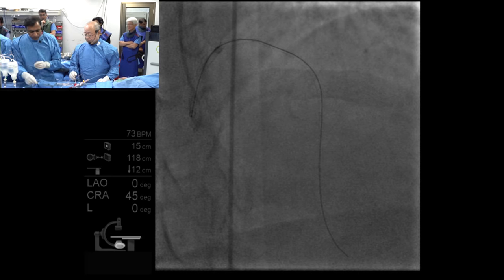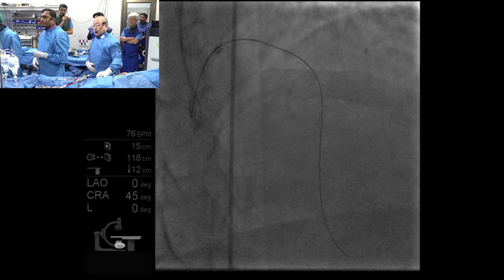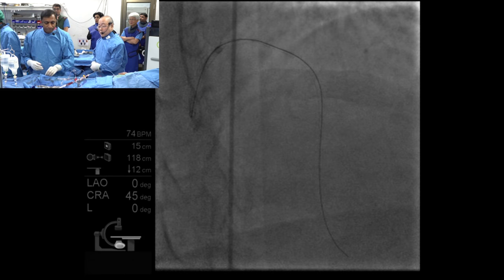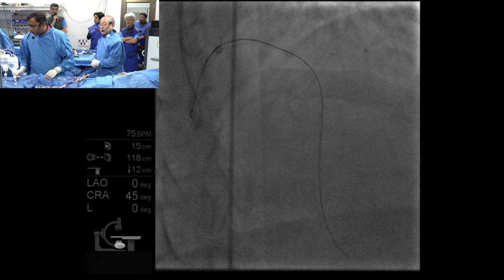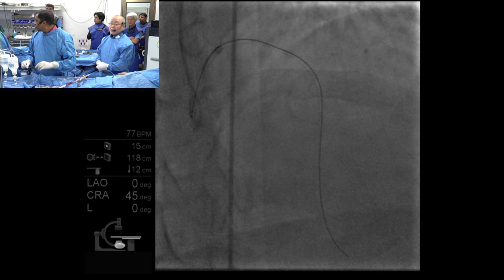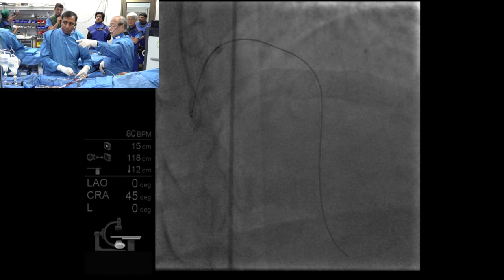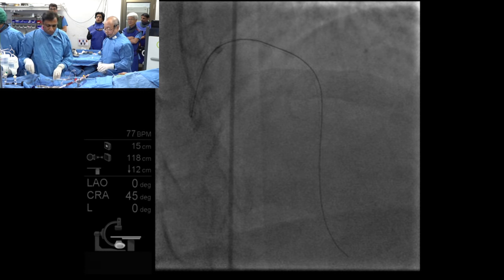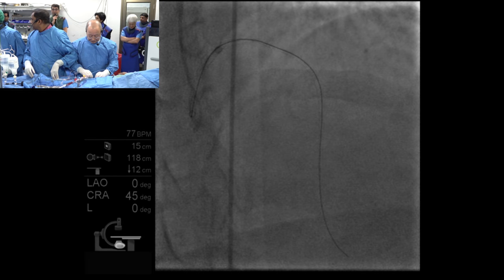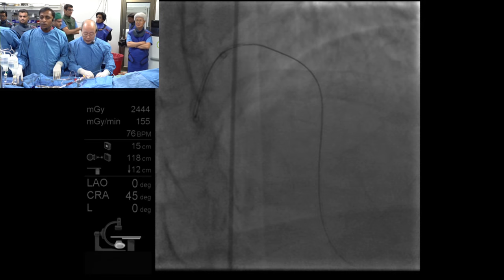Doctor, you have a very powerful guide position. There was an obscure LAD ostium, and your support is so solid that I think that's something to watch for, how he has achieved that powerful guide position to get the maximum support. From another projection, right? The guiding catheter position is quite nice. Yes, it's very good. The solid position you achieved with the guide is the reason behind the success of easily pushing through the balloon.